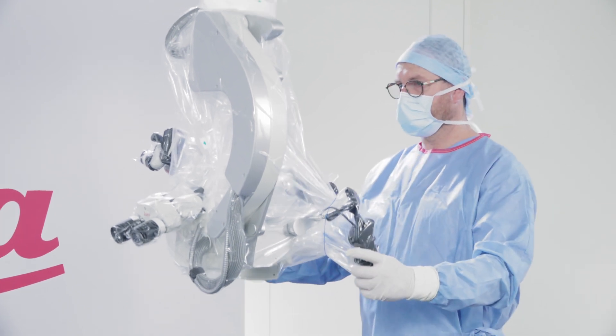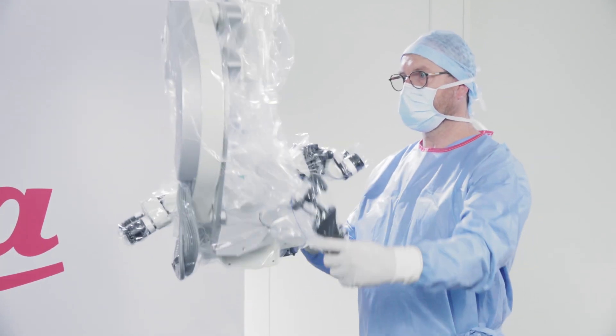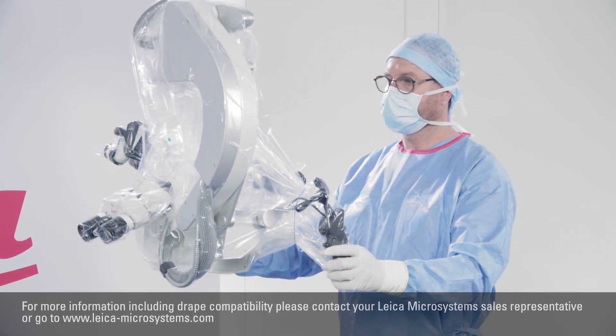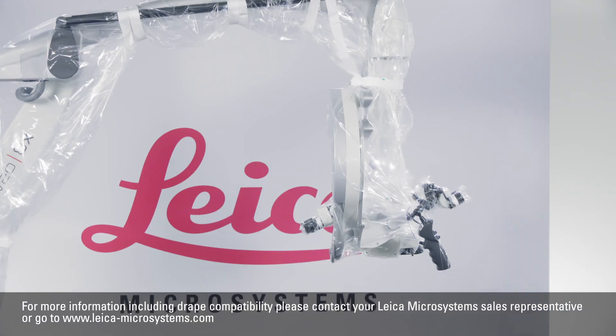Rotate the microscope to ensure that it can be moved easily in all directions. The drape shouldn't interfere with microscope movement. The Leica microscope is now ready for you to work with it.